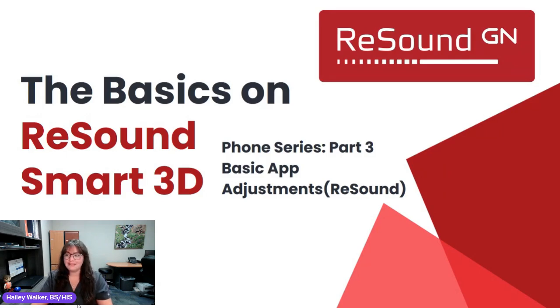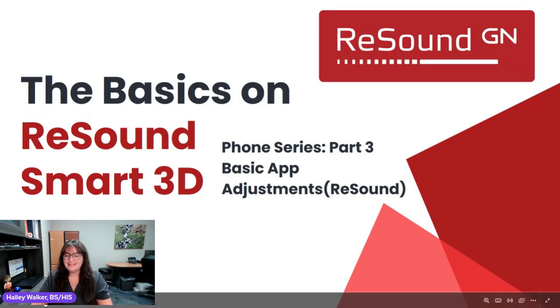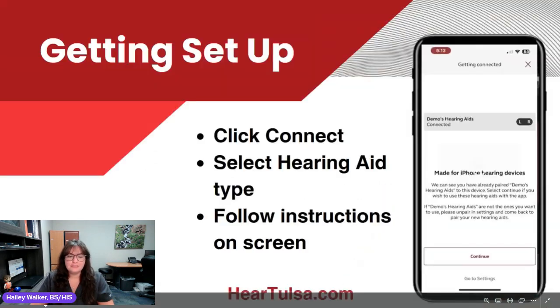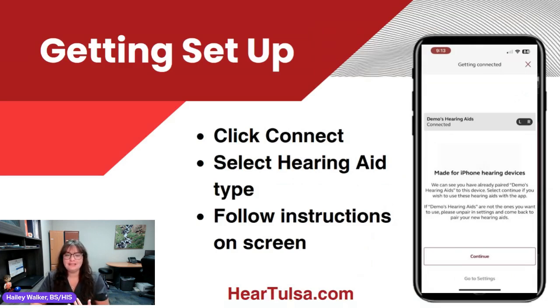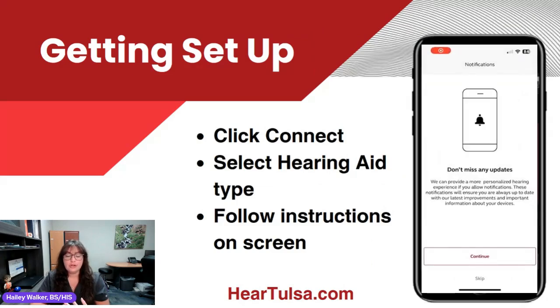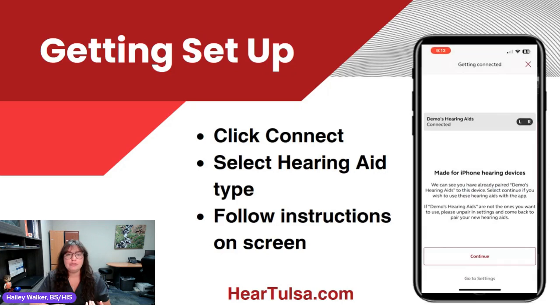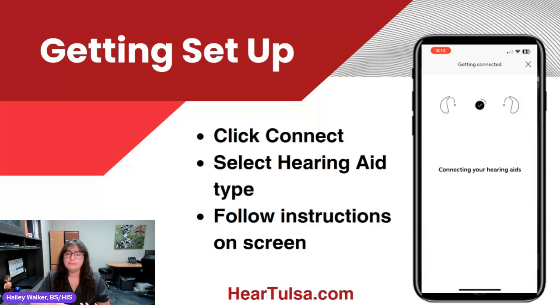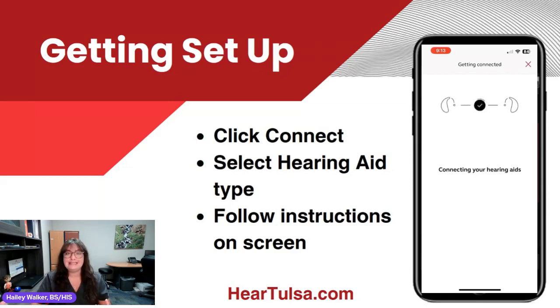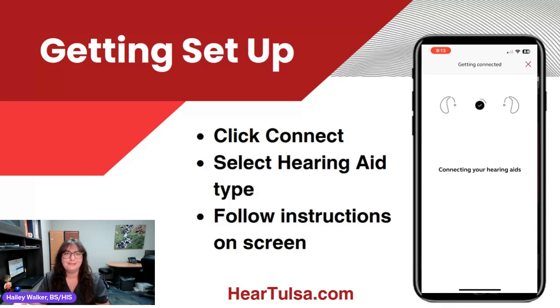So today we're going over that Smart 3D app. We're going to first start with when the app opens up. If we have an iPhone, this will be after we pair it to the settings. If we're on an Android phone, then this is where we're going to start. It should show our hearing aids that we want to continue with. We want to allow the Bluetooth notifications — that's up to you. I'd recommend leaving them on in case you have the ability to have your hearing care provider send settings over to you. That way the app will let you know when they have done that and you can update your hearing aids.